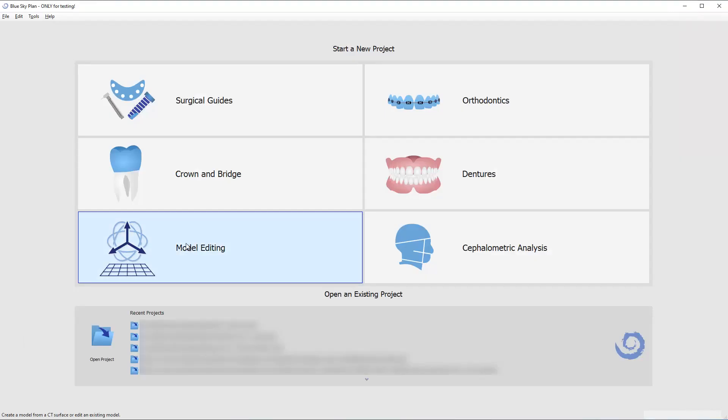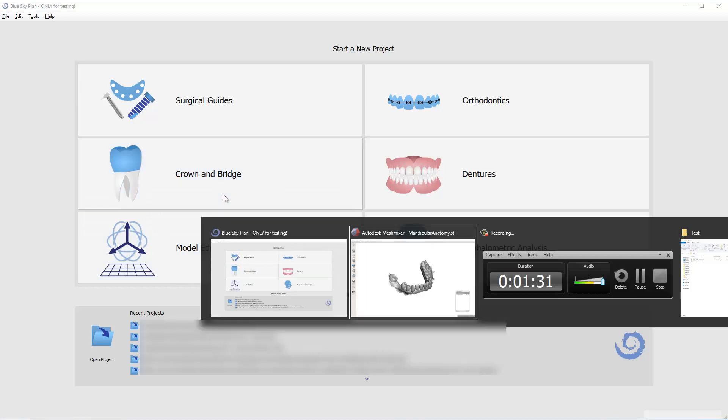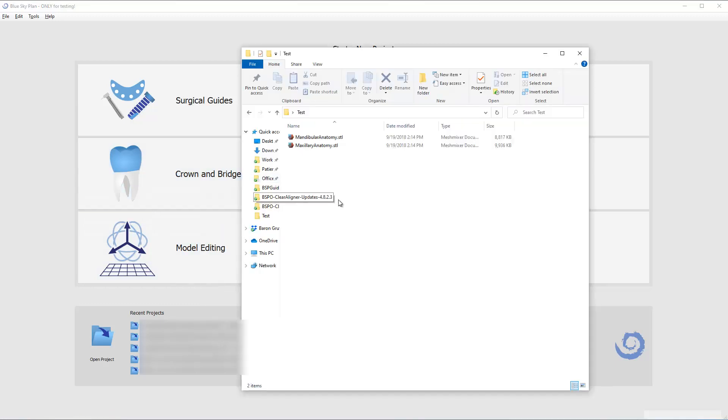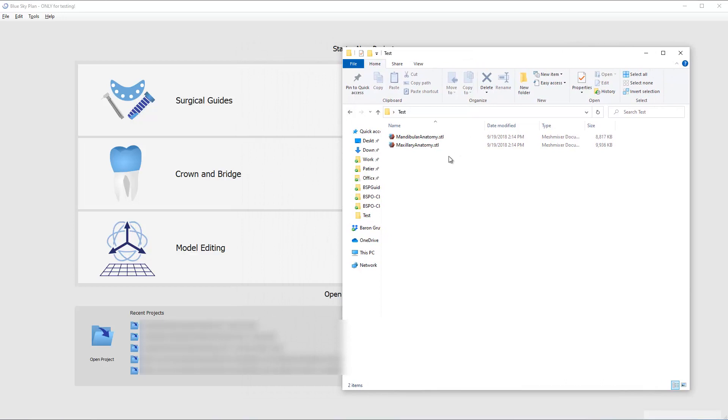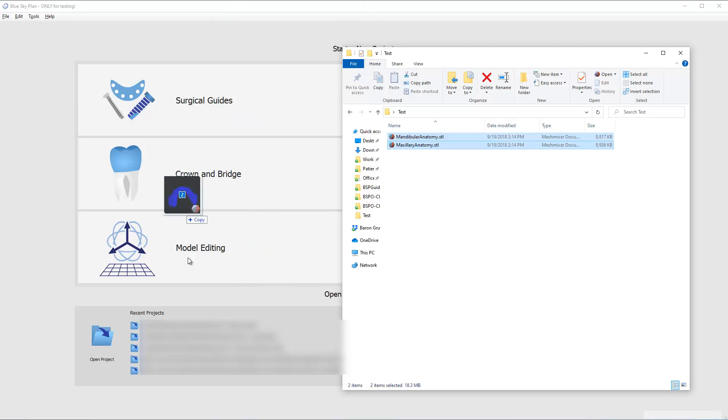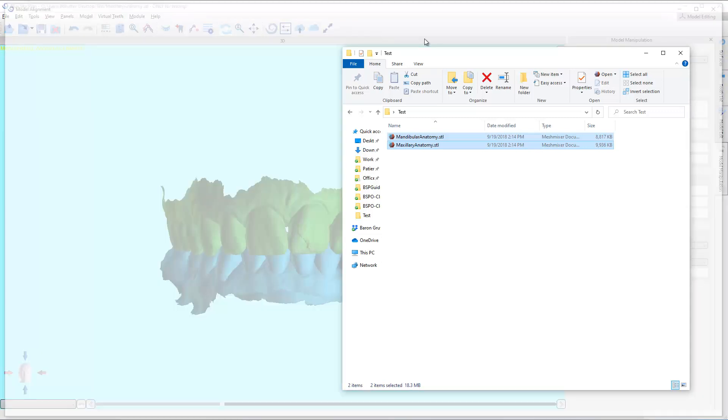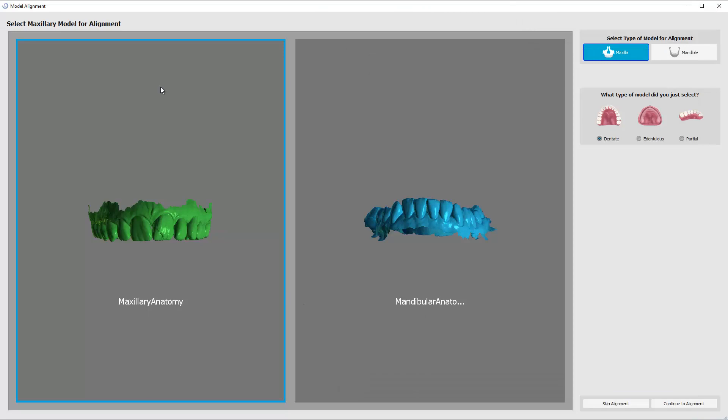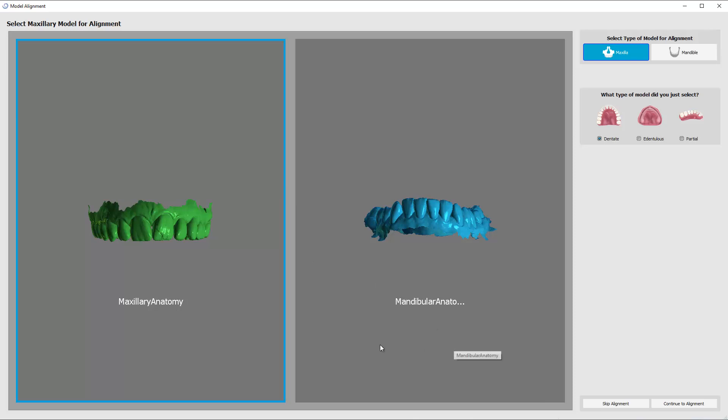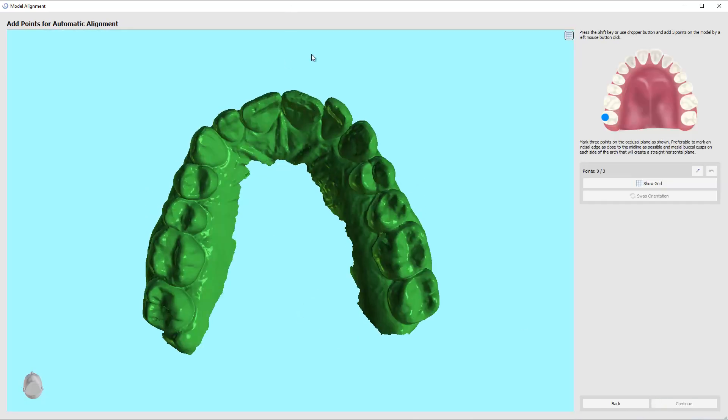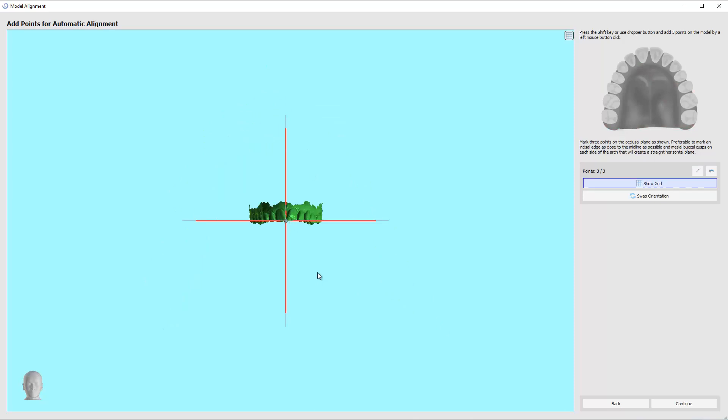The first thing we need is a set of models, and I'm going to select them both and drag them into the software. It's going to open us up into the model editing module. The first thing it's going to want to do is it's going to want us to align them. Hold the shift button to mark, mark, mark. And there it is.